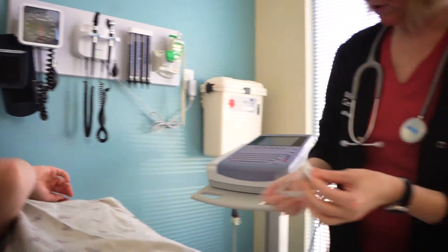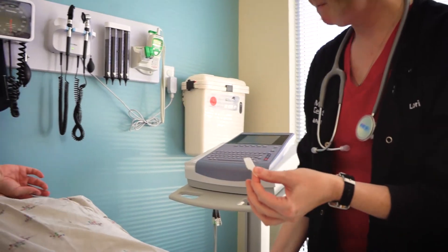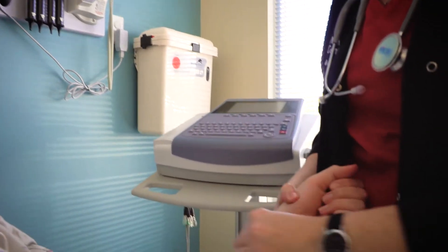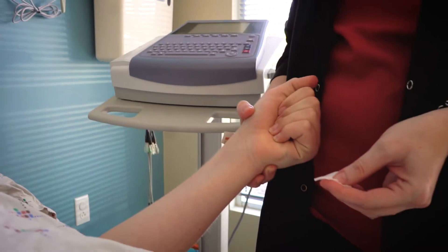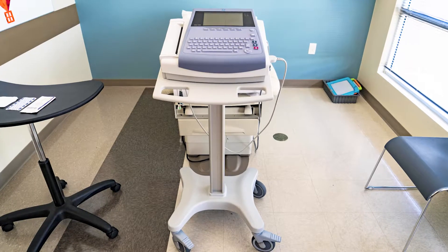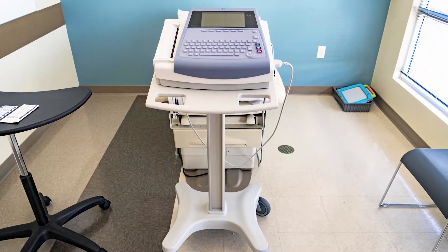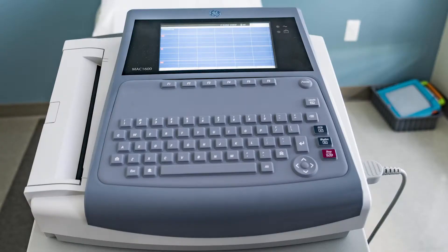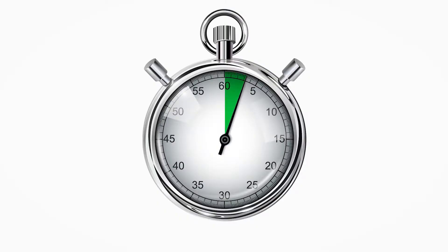Check with the patient and their family or support team to help with explanations. If possible, offer a choice to the patient to sit or lie down for the EKG. Before beginning the EKG, state a clear goal to the patient that they will need to hold still for 30 seconds. For some patients, practicing this goal may help to achieve a successful EKG. If possible, use a visual timer to help.